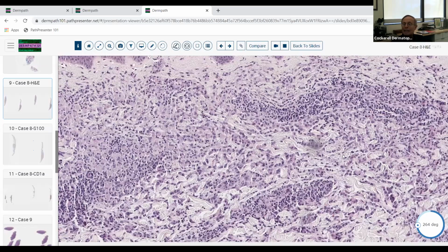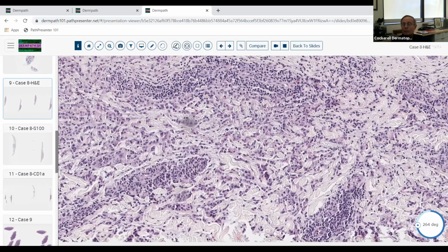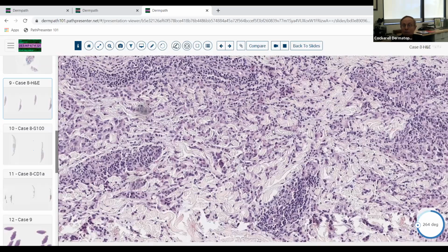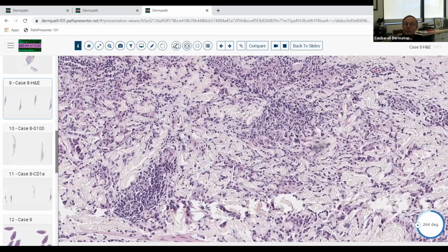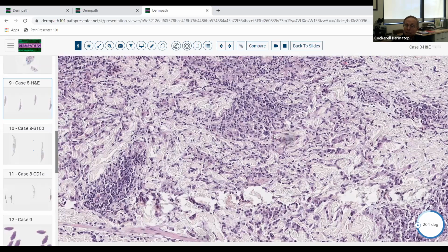The differential diagnosis of this pattern is really almost just two things that can do this. One would be eruptive xanthoma, which is what this actually happens to be. Eruptive xanthomas are relatively inflammatory. If you see the lesions clinically, they're often yellowish, but they can have some reddish or pinkish color sometimes, because they'll get some inflammatory cells in there as well, other than just purely these xanthoma cells.